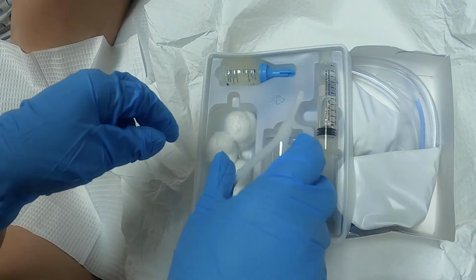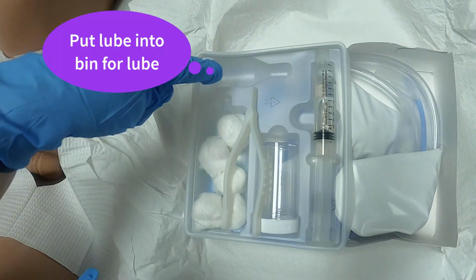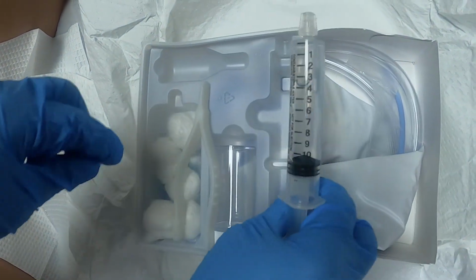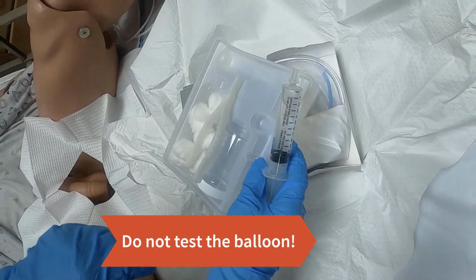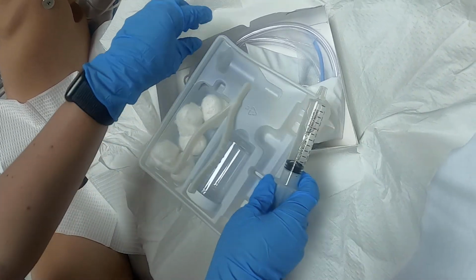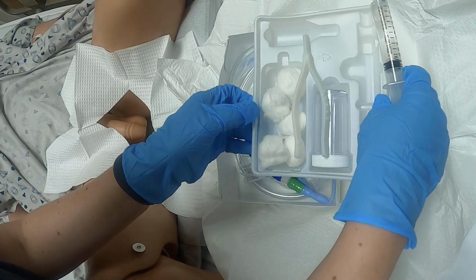Okay, my tweezers are right here. This here is my lubricant. Open this and put it all in here. Done. This here is my solution that I need for inflating my balloon. We do not inflate the balloon as a practice anymore to see whether or not it works. Because what happens with this is we might break the balloon before we even do anything.